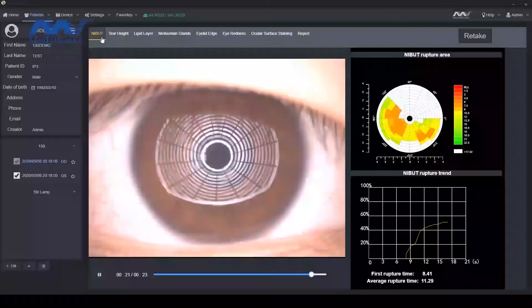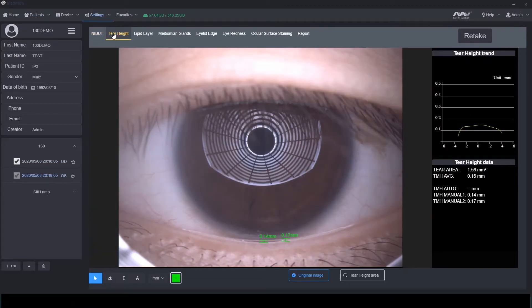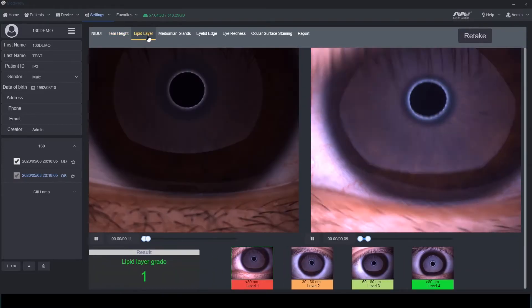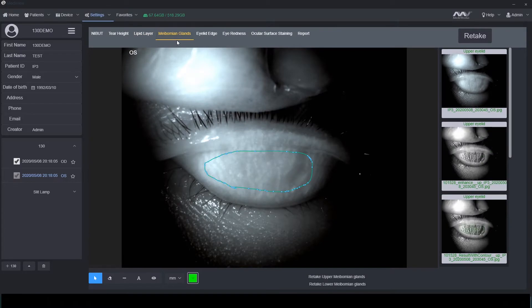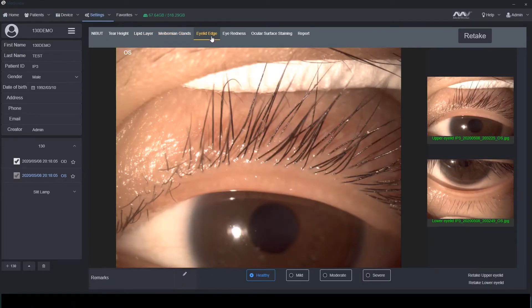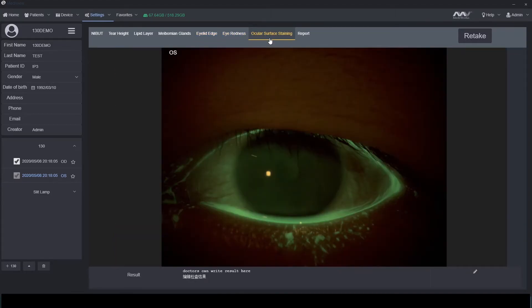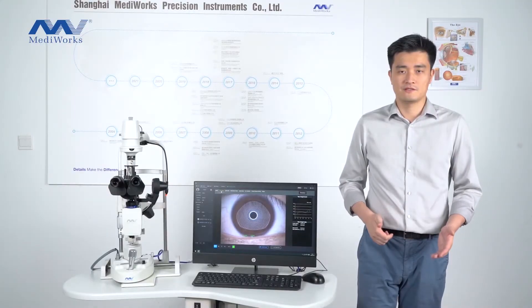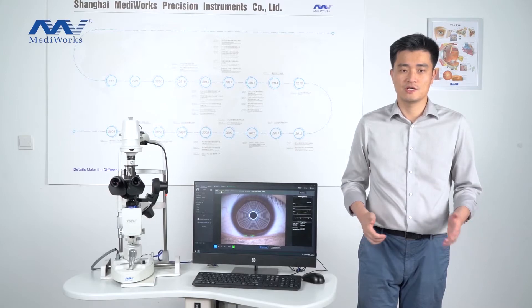This is our MediView software. There are seven examinations for the dry eye part: NIBUT, tear height, lipid layer, Meibomian glands, eyelid edge, eye redness, and ocular surface staining. There is an operation guide for when you do each examination.